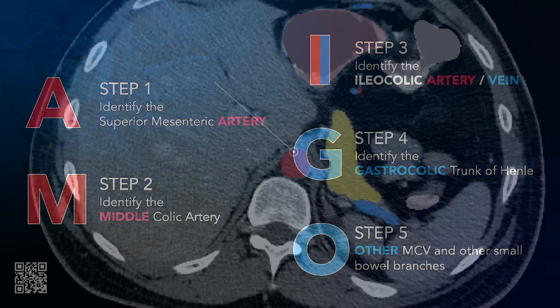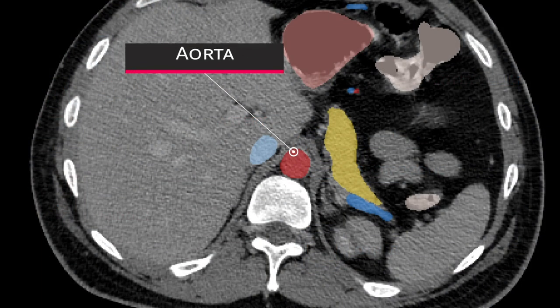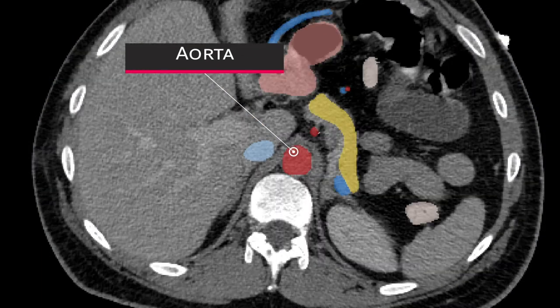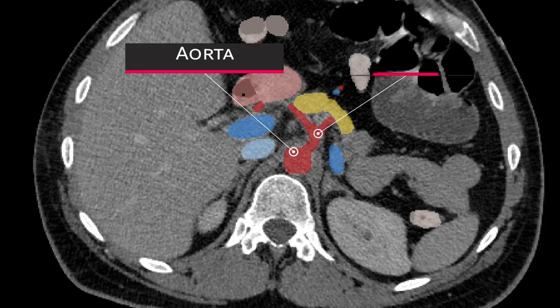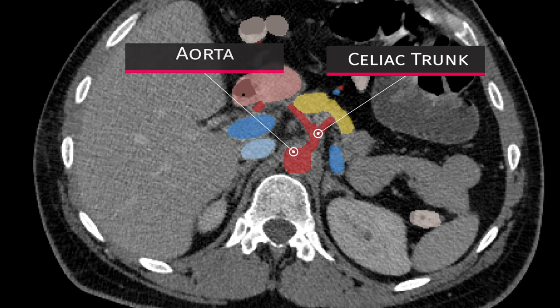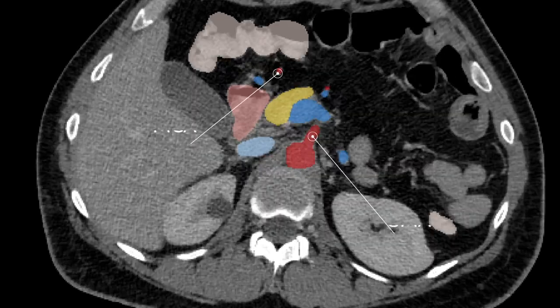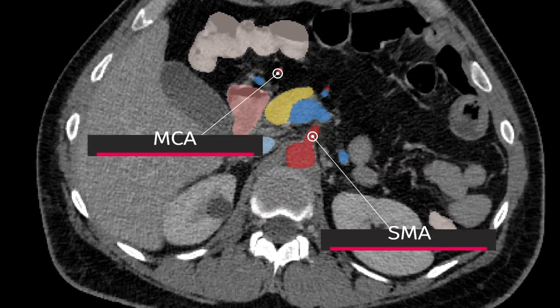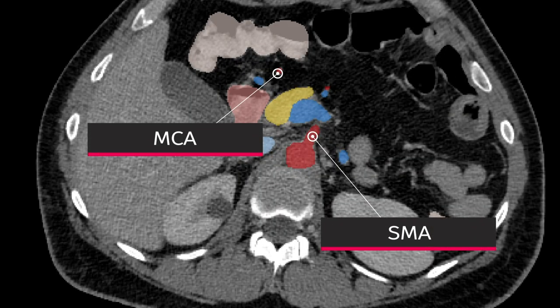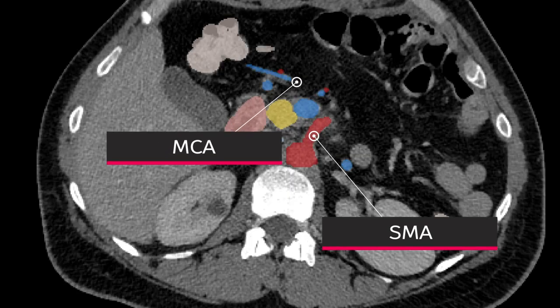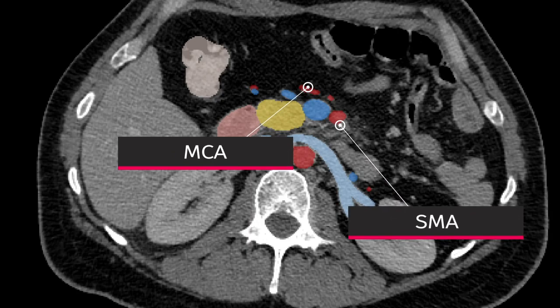After identifying the aorta, we follow cranially to identify the SMA, which arises anteriorly off the abdominal aorta just inferior to the celiac trunk. We then trace the course of the SMA until we identify the origin of the middle colic artery, typically found emerging distal to the inferior border of the pancreas.